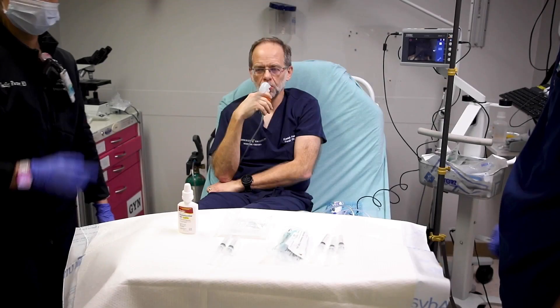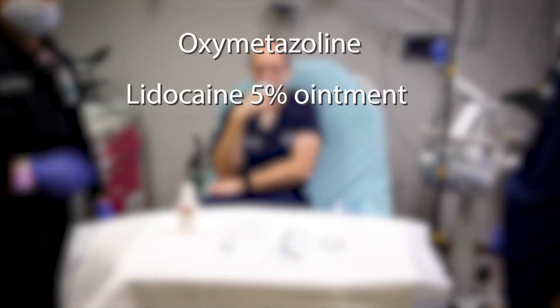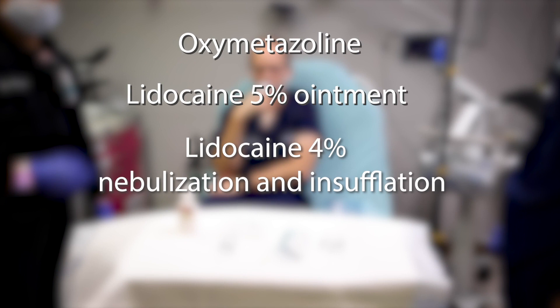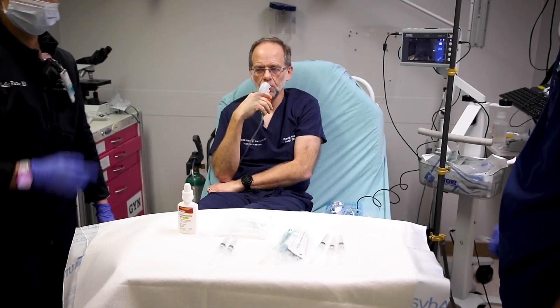We demonstrate an awake fiber optic nasotracheal intubation performed on one of our senior faculty using only oxymetazoline, lidocaine 5% ointment, and lidocaine 4% nebulization and insufflation to topicalize the mucous membranes. Our faculty experienced minimal discomfort. The only untoward sensation he described was slight difficulty swallowing secretions during lidocaine nebulization. This should be conveyed to the patient prior to the procedure.